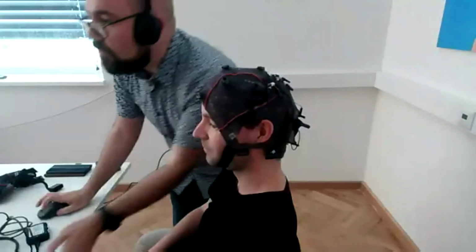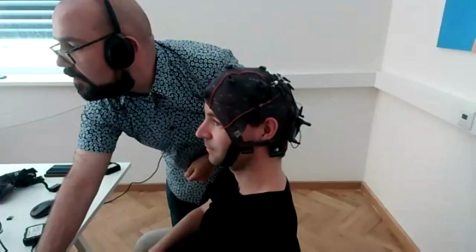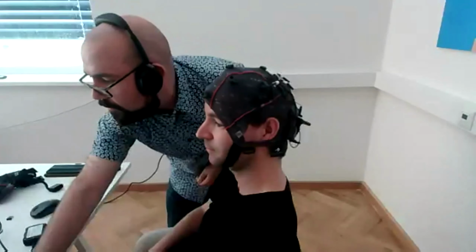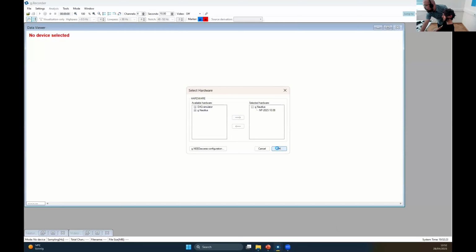Let me connect to the g.Recorder. Okay, let me go back to, yeah, thank you. Yeah, we turned off. I can start sharing the screen as well. Let me see, share the screen. Good. We will do the same thing. We will just press the setup, settings, select hardware. The device is blinking, so it should be able to connect. We can see already the g.HIamp disappeared. We add the g.Nautilus, we press OK.